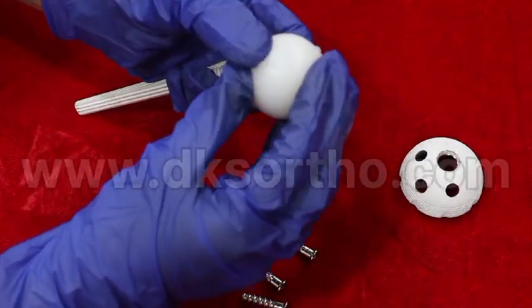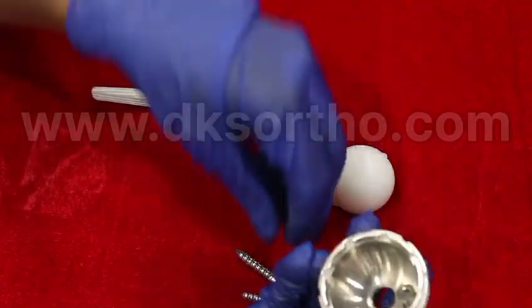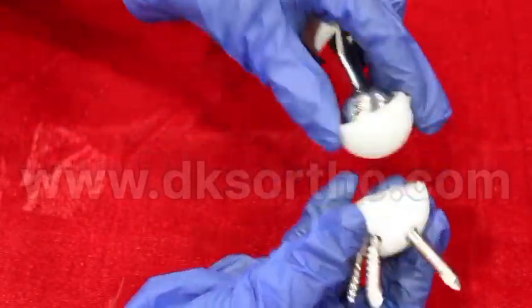The acetabular cup is uncemented. It is fixed using screws, assembled together like this.